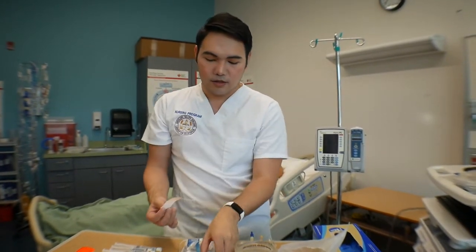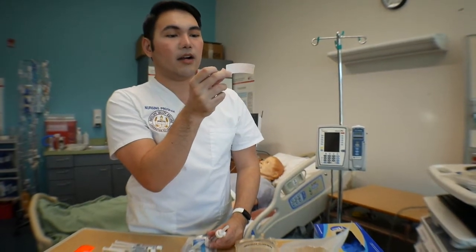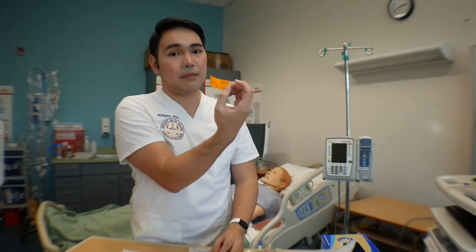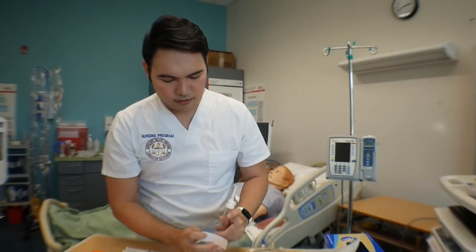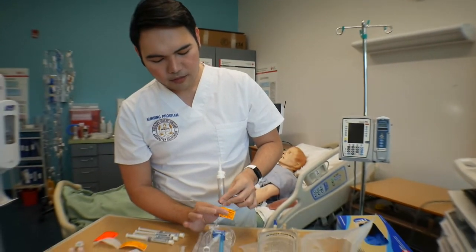So primary tubing and secondary tubing usually last for 72 hours, depends on your hospital protocol. So since today is the 6th, it's gonna expire on the 9th. It's gonna be 72 hours. So make sure you put your initial on the time and date. So I usually put it here under the chamber.